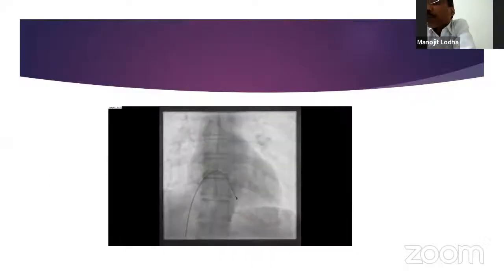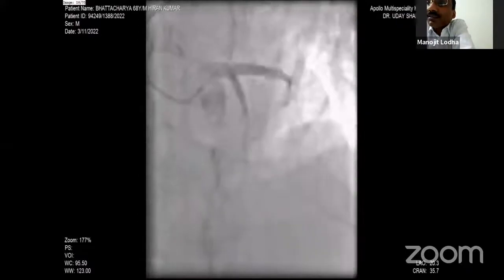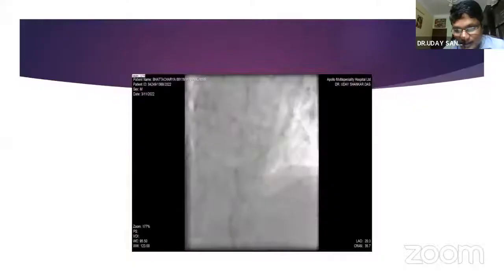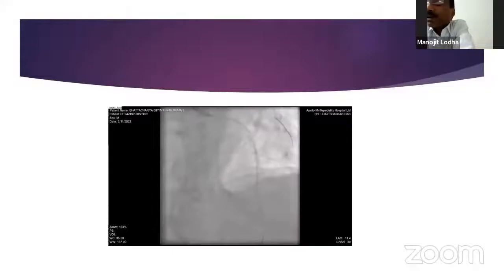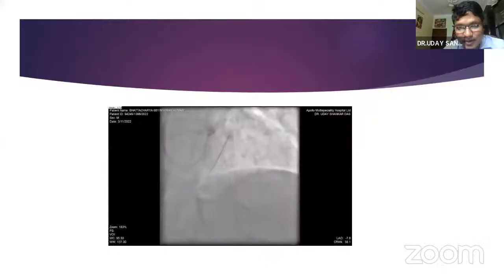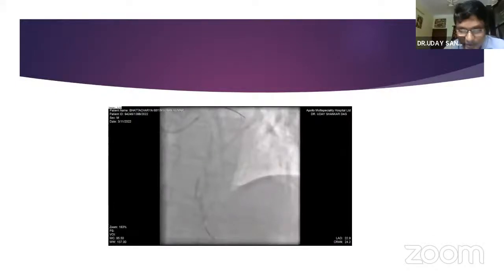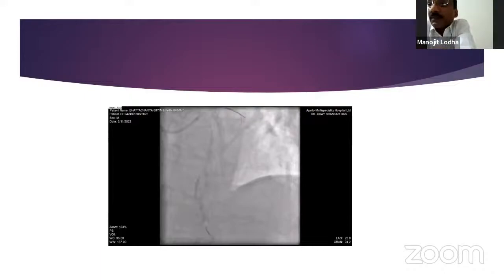And in the first case, when you put the first stent, the distal stent, how was the flow in the LAD before that? After the first stent distally? Yes. After the first stent, it's not too good, not too bad. Rather, I would say not too bad. But after deploying the proximal stent, the flow was quite bad. So I checked for proximal edge dissection, but it's not there.